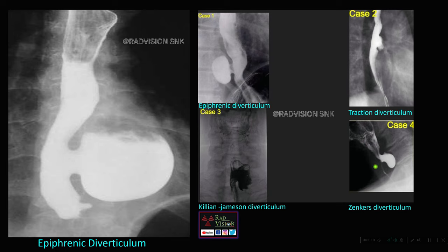Both of the following are located in the upper one-third of the esophagus. This is Killian-Jamieson diverticulum, usually on the anterior and anterolateral aspect, typically on the left side just below the cricopharyngeus muscle. Here, this is Zenker's diverticulum, arising from the posterior and posterolateral aspect of the upper esophagus at the level of the upper esophageal sphincter — the cricopharyngeus muscle. There will be herniation of the mucosa and submucosa through Killian's dehiscence. This is a case of Zenker's diverticulum.